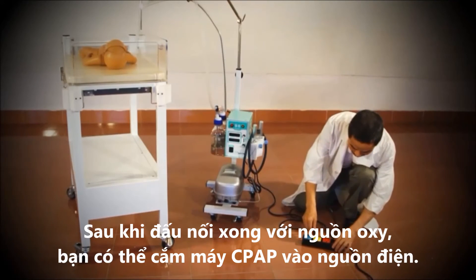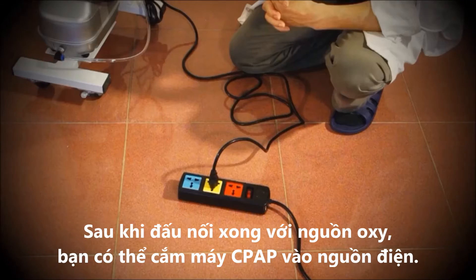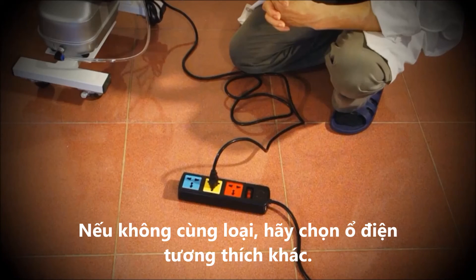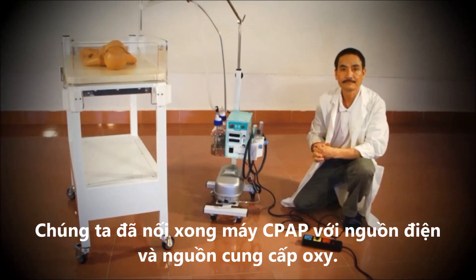Once the oxygen source is connected, you can connect the CPAP to a power source. Make sure that the power plug is the same size and shape as the one provided with your CPAP. If it is different, please use the appropriate adapter. The CPAP is now connected to the power and oxygen sources.